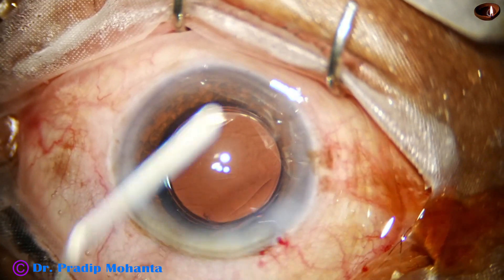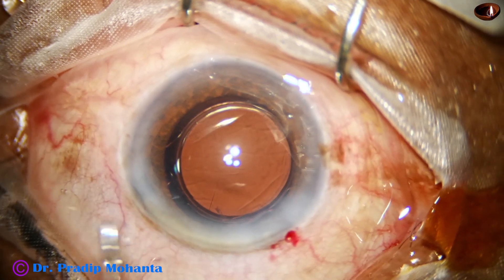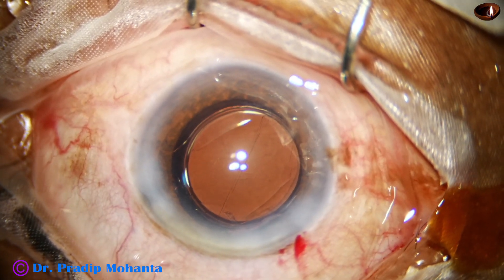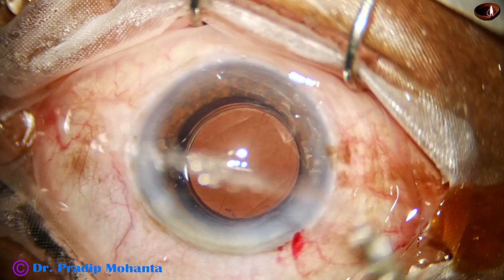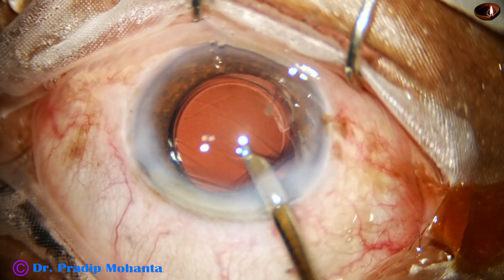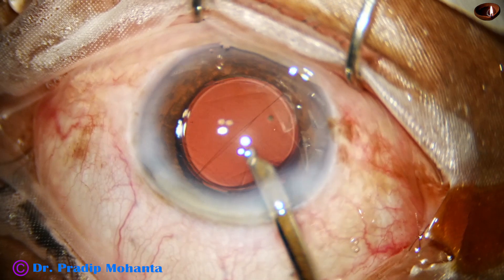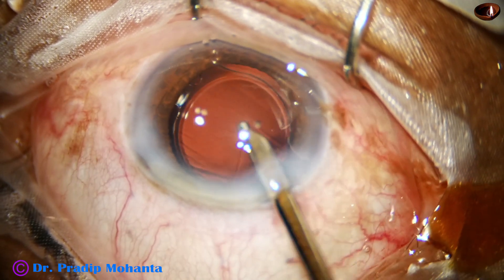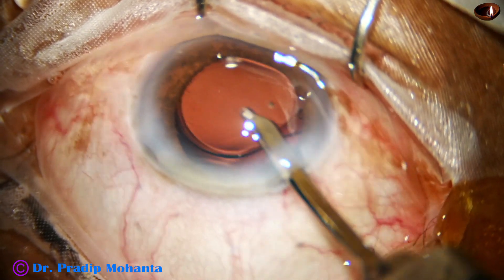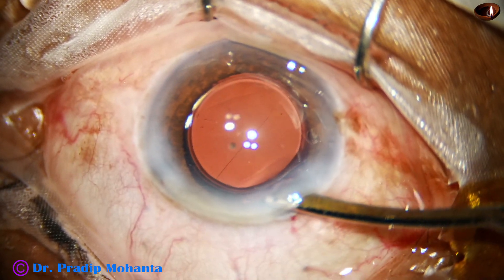And this is moxifloxacin. The side port is closed by hydrating the corneal stroma. This is the final lavage of the anterior chamber. I am trying to remove this small speck of cortex at 12 o'clock. We have to remember a quote of Dr. Uday Devgan: 'Be good, do not try to be perfect.'